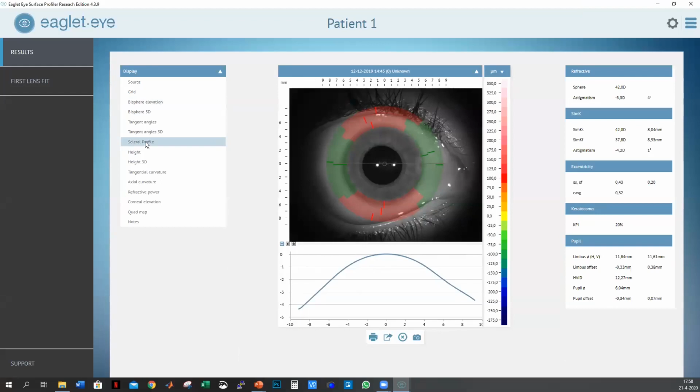So you switched your color coding here. Well, what we in fact have is quite a sophisticated asymmetry calculating algorithm. So you shouldn't see it as another kind of elevation map, because it's not.